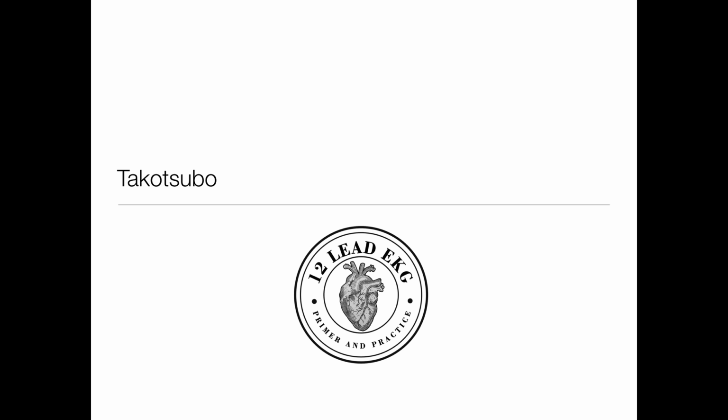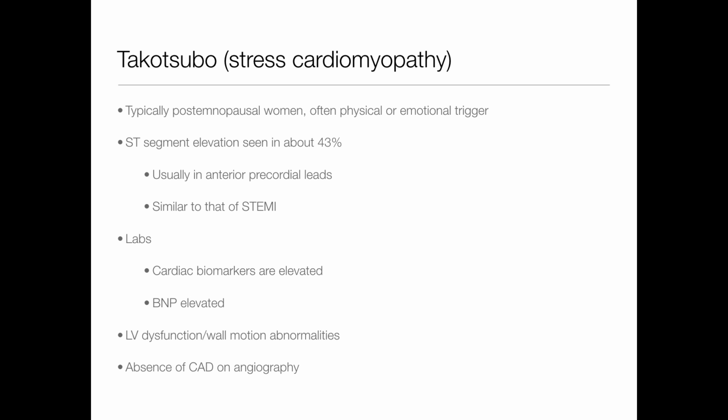Takotsubo, baby. Okay, this is a really neat and interesting condition. It's what we call stress cardiomyopathy. And so these patients have absolutely no coronary artery disease, but they come in with ST elevation and symptoms that look just like an MI. And typically what we see is it's in postmenopausal women, and it's an emotional trigger that caused this thing to happen.